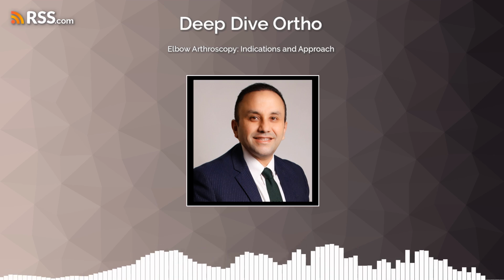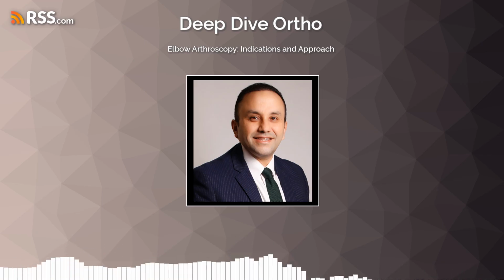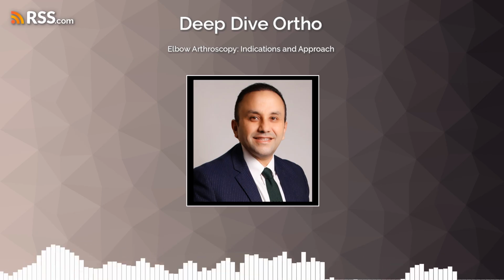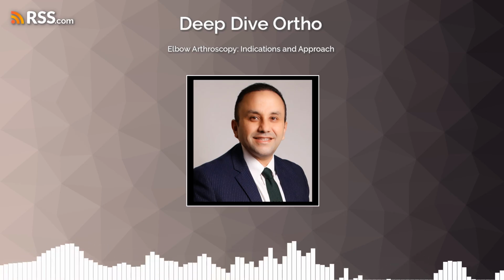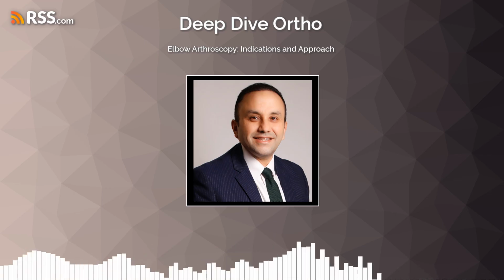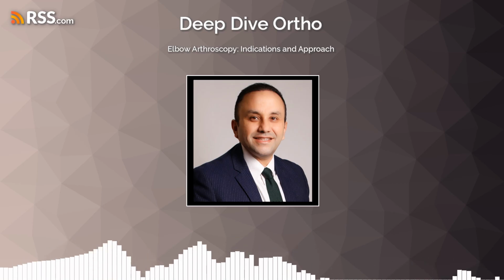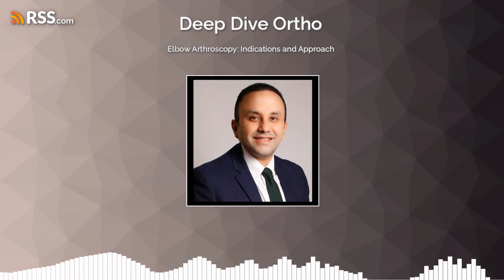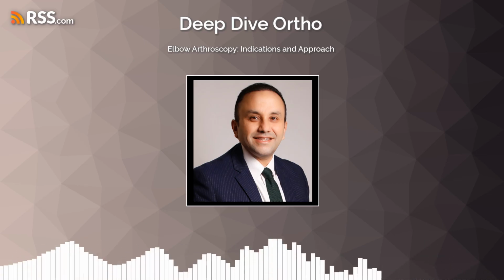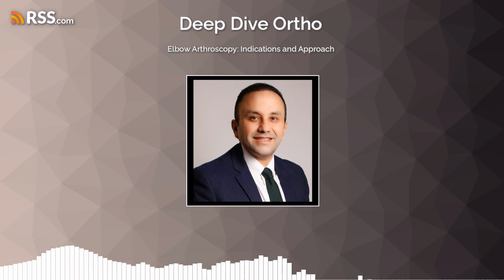What are the outcomes like, and are there significant risks with arthroscopic fracture fixation? Regarding outcomes and complications, reported outcomes for arthroscopic fracture treatment are generally positive. Postoperative stiffness can occur, especially in post-traumatic cases, and may occasionally require further release. While some series have reported no neurological or vascular lesions, the risk of neurovascular injury remains due to the elbow's complex and dense anatomy. Arthroscopic treatment for fractures requires deep knowledge of traumatology and both open and arthroscopic elbow surgery, indicating it's a sophisticated technique that continues to evolve and demands a high level of surgical expertise.